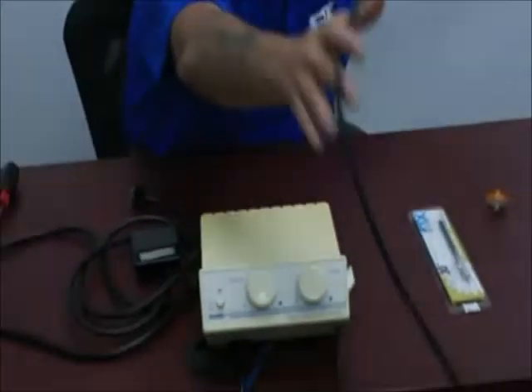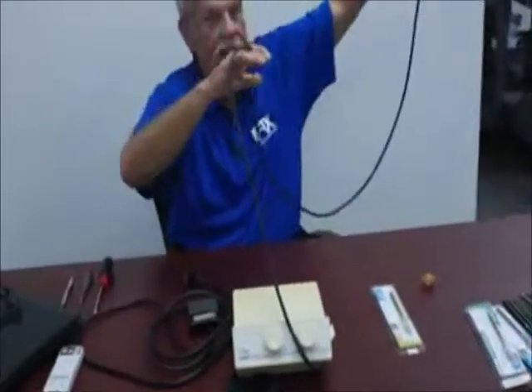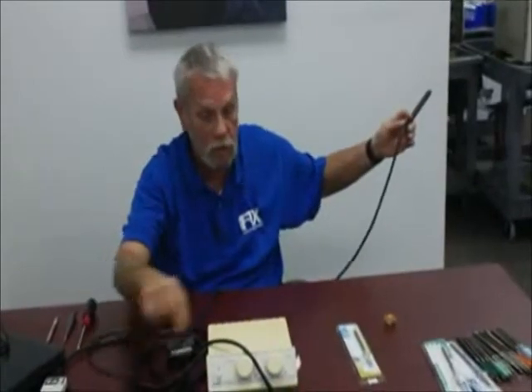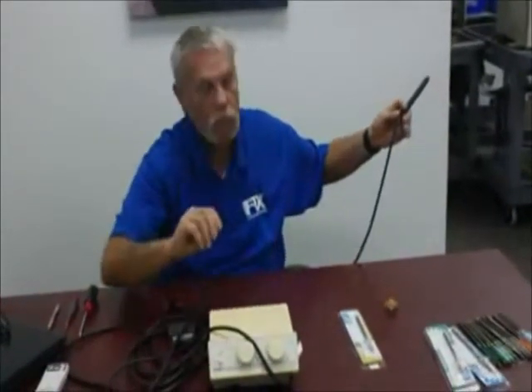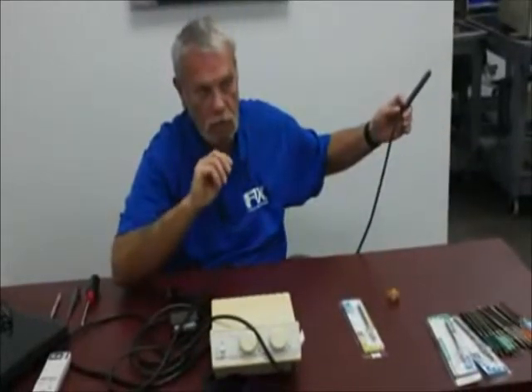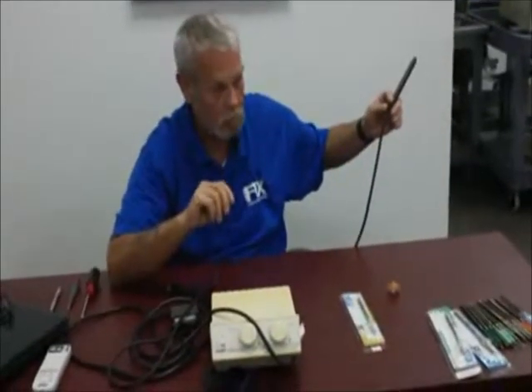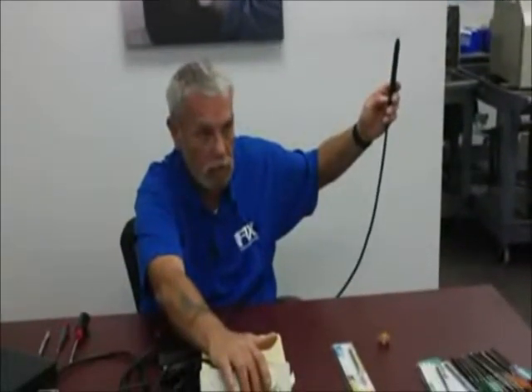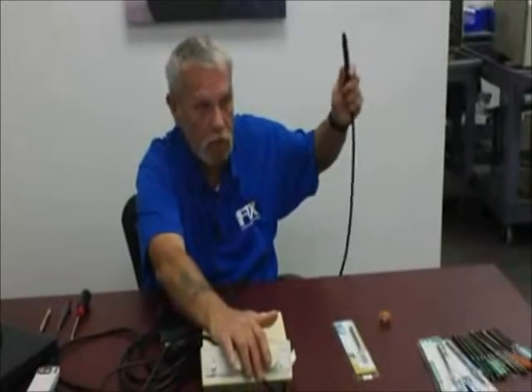Our next component is the handpiece and cord assembly. This is a field replaceable item. You can either replace just the cords on the inside, which calls for much precise soldering, or you can replace the whole handpiece and cord assembly, which is what I strongly recommend you do.